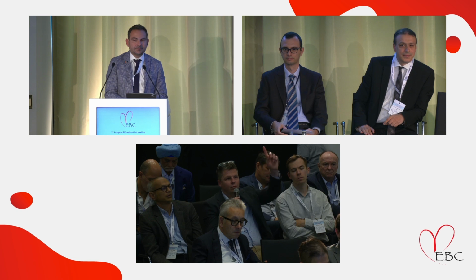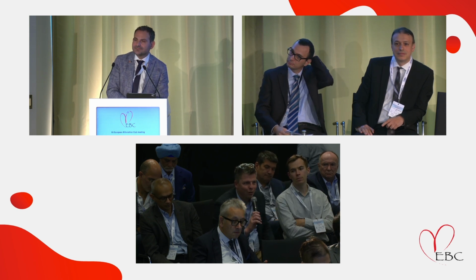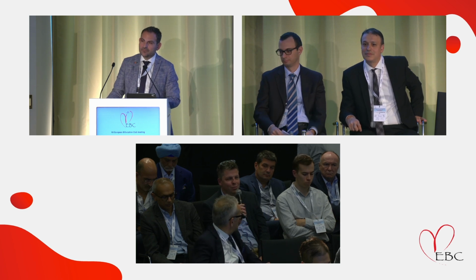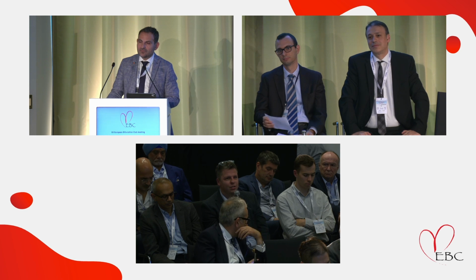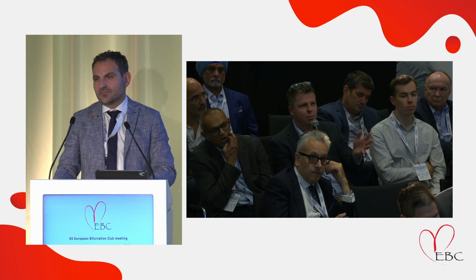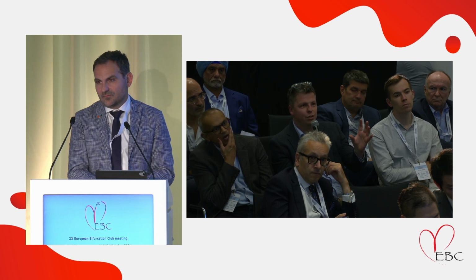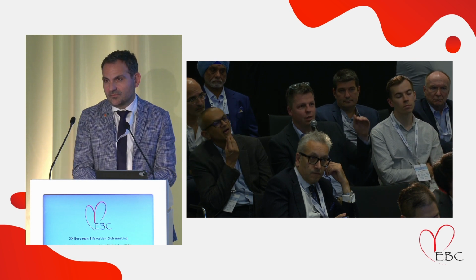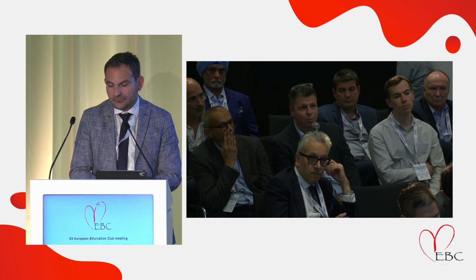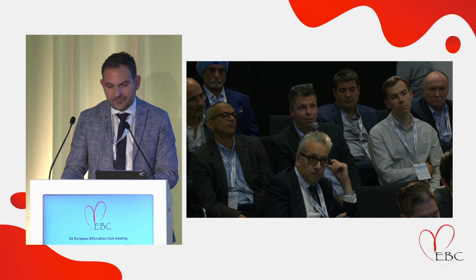There is a question over there. Yeah. Hi, great work. I understand quite a few of the challenges with this because we've been doing some similar work with OCT. One of the issues is that IVUS understands the arteries as a straight tube. You can create a 3D shape. So when you deploy this clinically, how do you turn the straight IVUS tube into an artery that has a center line that follows the true course of the artery? Is it informed by CT or AI or angiography?